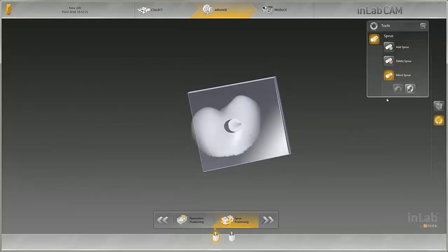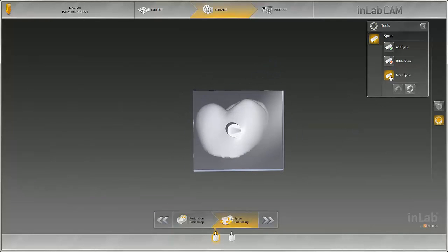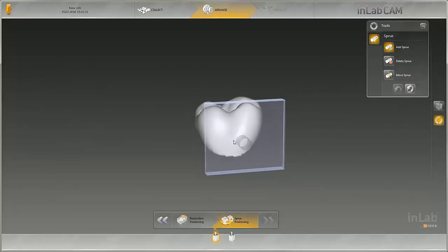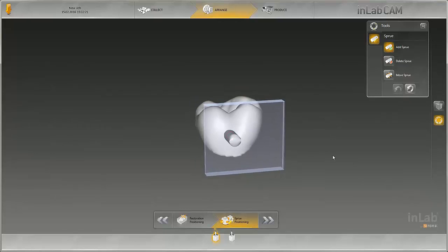In addition, connectors can be moved, deleted, or created. As such, the position of the connector can be adapted individually to the restoration.